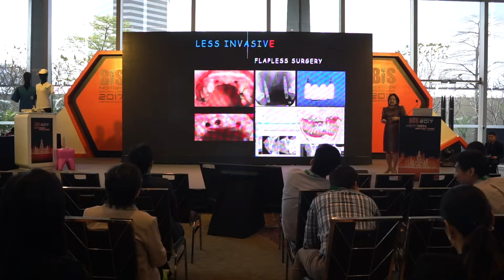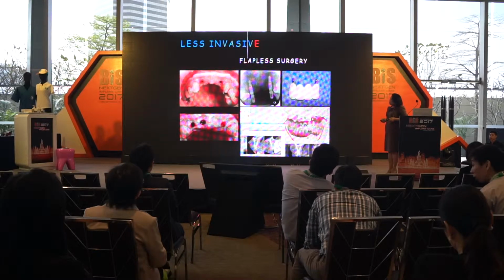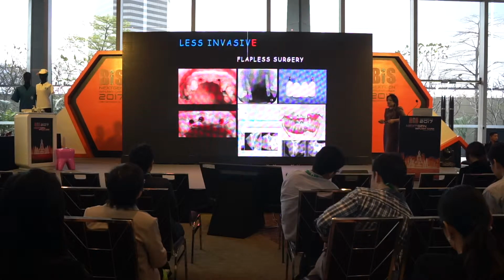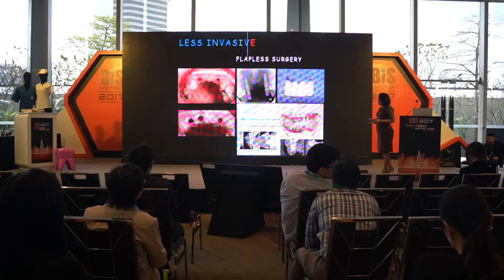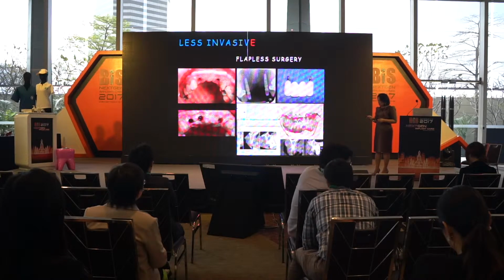Also, guided surgery allows you to do less invasive, flapless surgery. You can place the implant without opening the flap and can make the provisional crown in advance, and also you can measure the bone and the restoration, and try it in the patient before we place the implant.